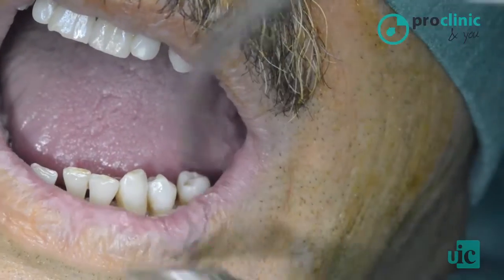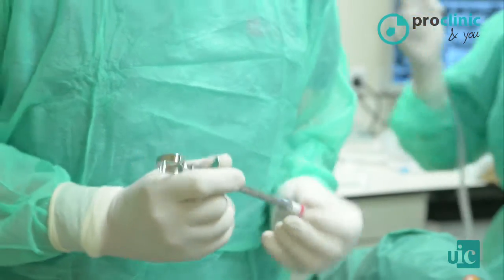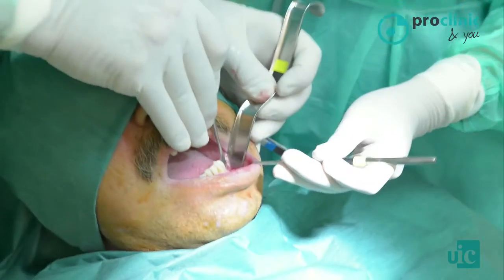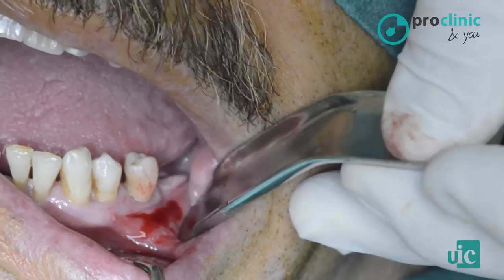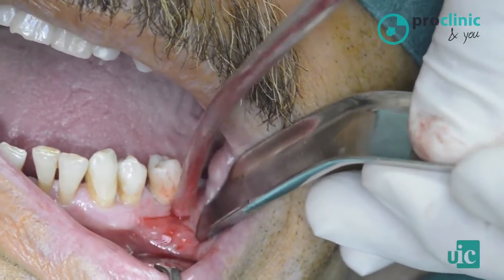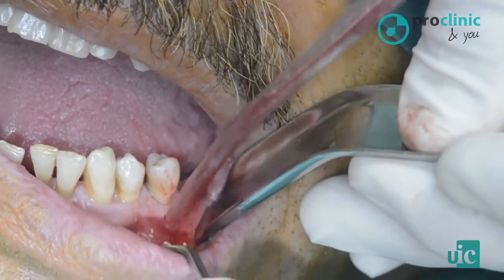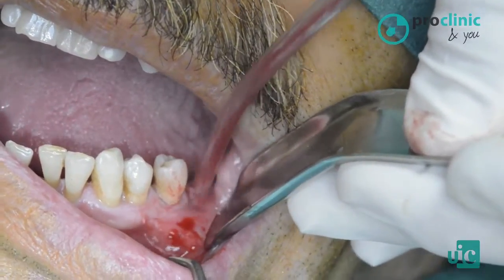Now we need to wait a few seconds because the anesthetic is starting to have its effect. It is fast. The patient feels pressure when we are infiltrating the anesthetic. Sometimes the patient is confused and thinks he can feel pain. But actually what he feels is just pressure when the liquid comes into the soft tissue.